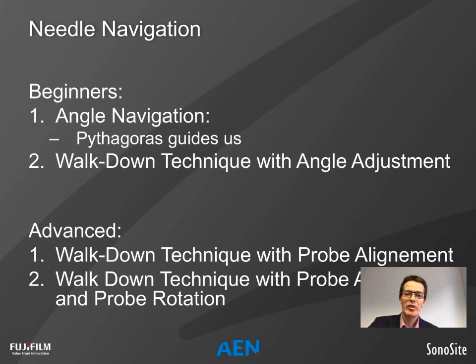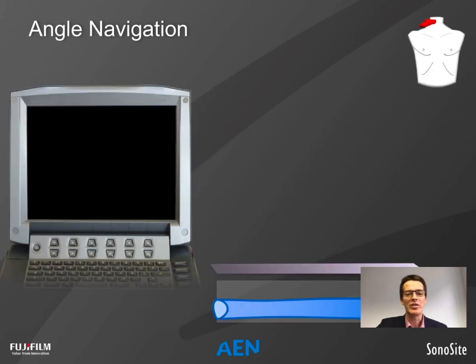We have divided these methods into those for beginners. We talk about angle navigation and a walk-down technique with angle adjustment. For more advanced users, we talk about the walk-down technique with probe alignment. And at the end, the smartest and, as we believe, the safest technique is the walk-down technique with probe alignment and probe rotation. So let's go over this.